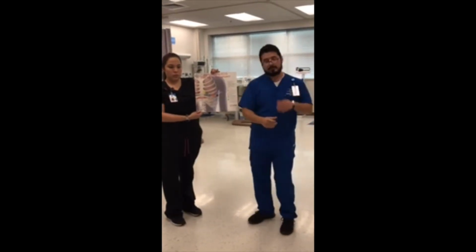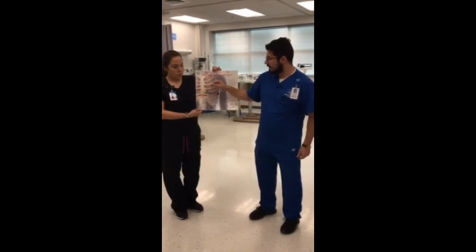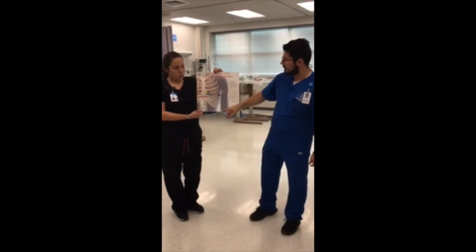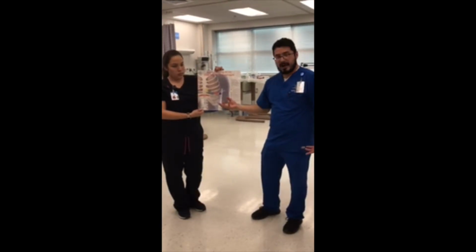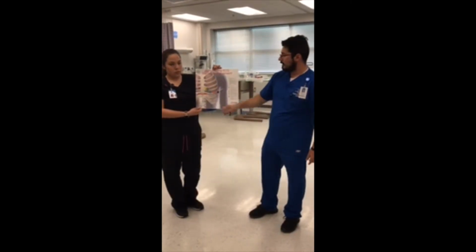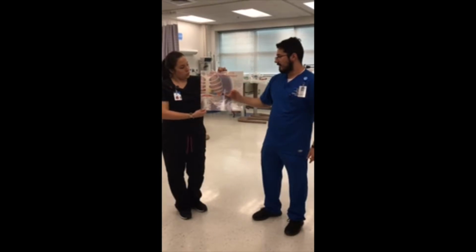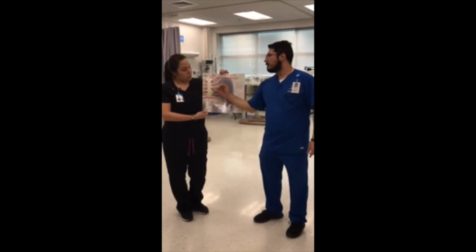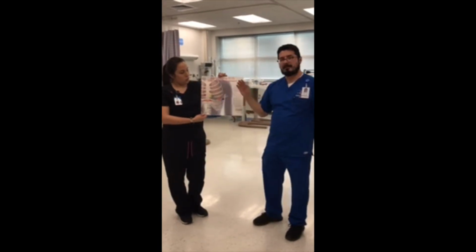A good way to see these pictures is understanding that each one of these leads, right arm, right leg, left arm, left leg, together gives you an angle, like a camera angle of how it is looking at the heart. An example would be from V6 to right arm, giving you the view from the mid-axillary position on the left side to the right arm lead. That angle is what we're looking at for that.